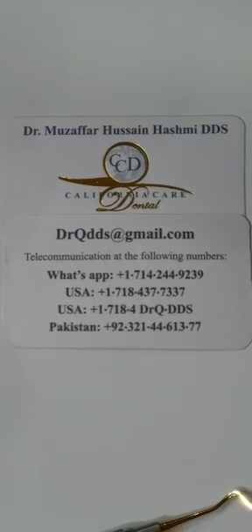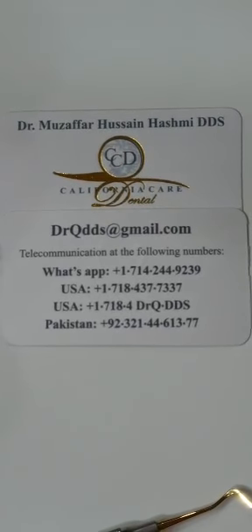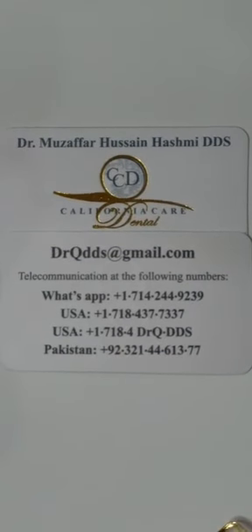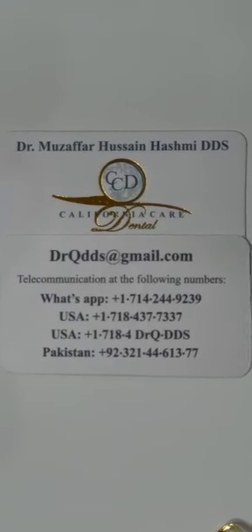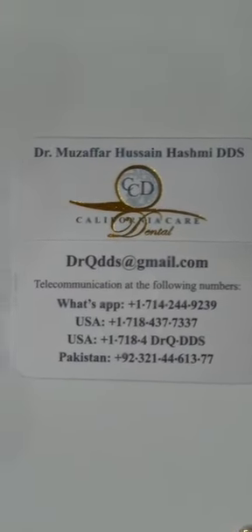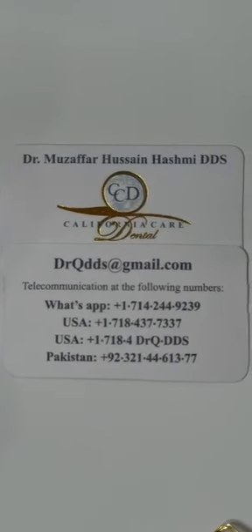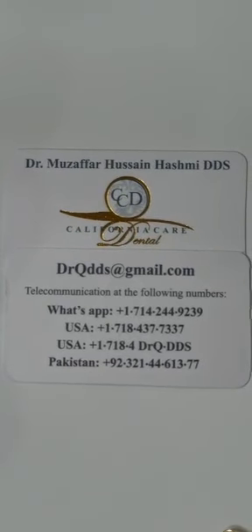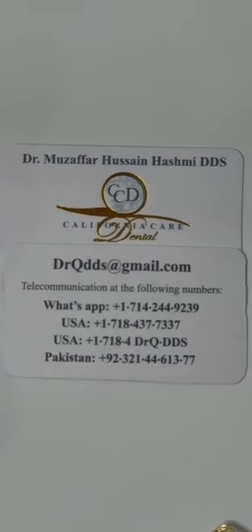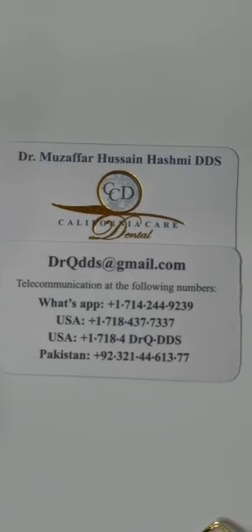Welcome to California Care CCD. Today we are going to talk about building occlusal blocks to disclude the occlusion in front. This procedure might be needed if you are discluding for full bite restoration, opening up the bite and doing crowns on posteriors as well as anteriors, to disclude the bite and make new occlusion with a new occlusal table. It might also be temporarily needed if you're doing orthopedics or orthodontics. Today we'll talk about the procedure on how to disclude the bite bilaterally to keep it balanced.